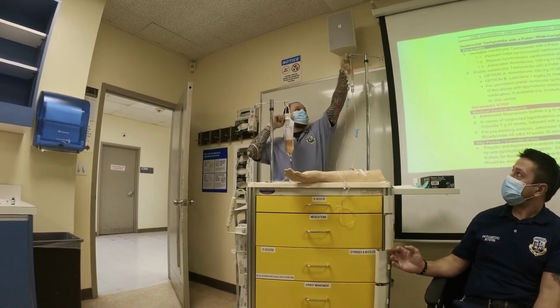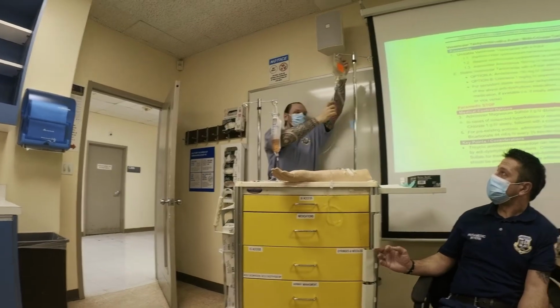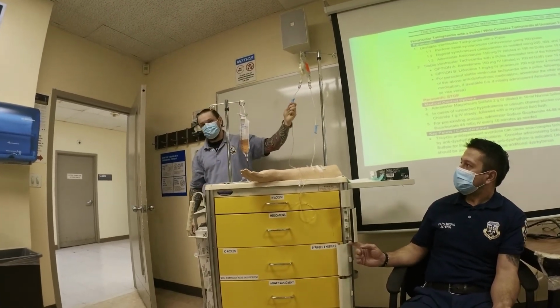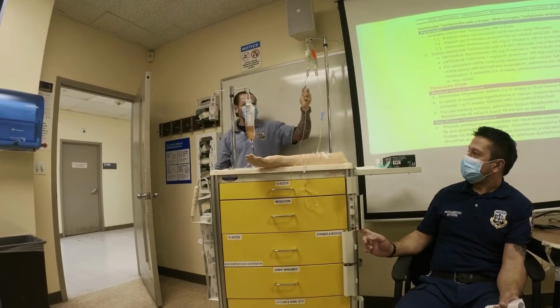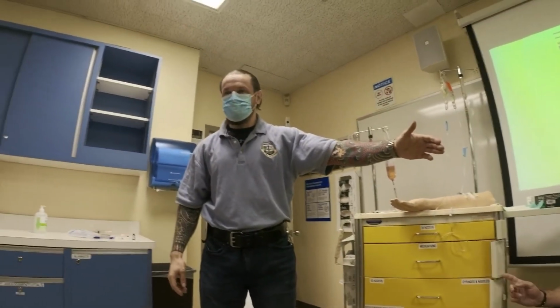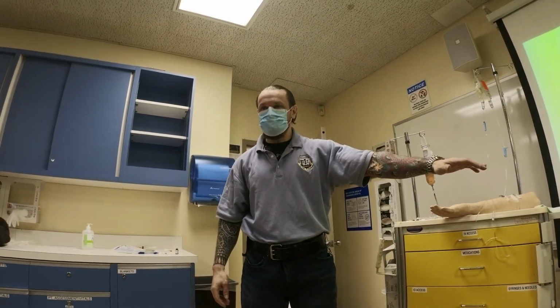And what do I do with the patient? Lay him down, right? So I open this up. This can happen in a matter of seconds, right? So I open this up and I start infusing my fluids. I lay him down and I'm going to reassess my patient, right? Usually you will infuse the medication and you will see the evidence of chemical cardioversion, right?